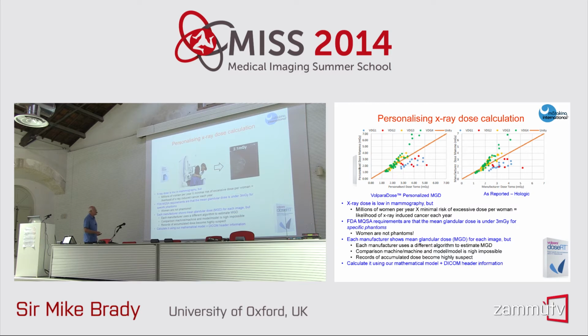But there's a problem. If you've got millions of women, 75 million women having a mammogram every year, and you've only got a minimal risk of excessive dose per woman, it still means that you're going to get a likelihood of an X-ray induced death each year. Right? It's bound to be. As the Scots would say, mony a mickle, mach a muckle. Lots and lots of little things make a big thing.